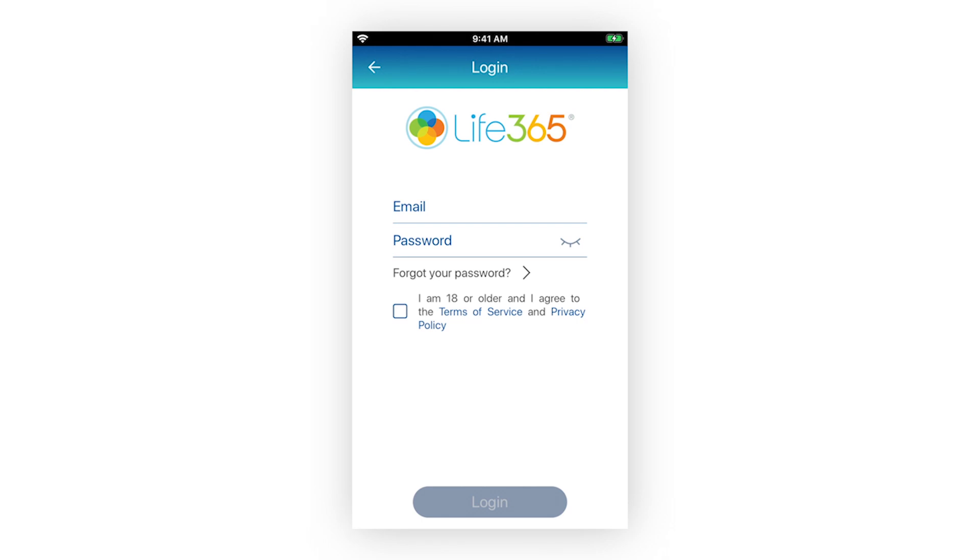If you have forgotten your account password, select the Forgot Your Password link to receive a password reset email notification. Follow the instructions detailed in the email to reset your account password.